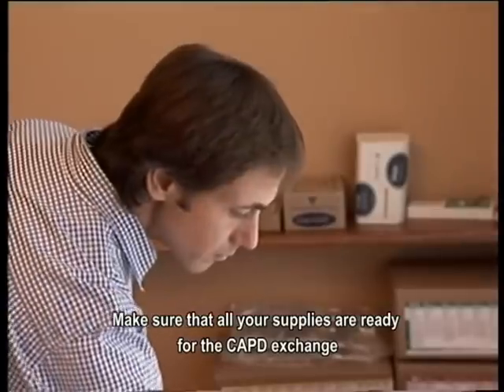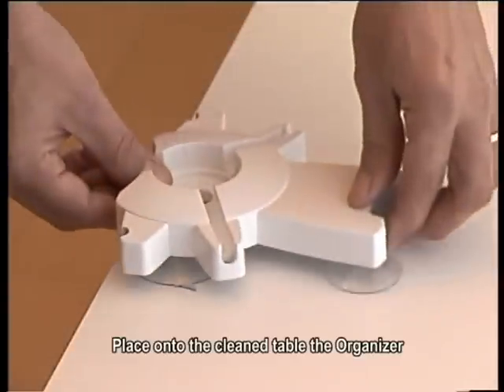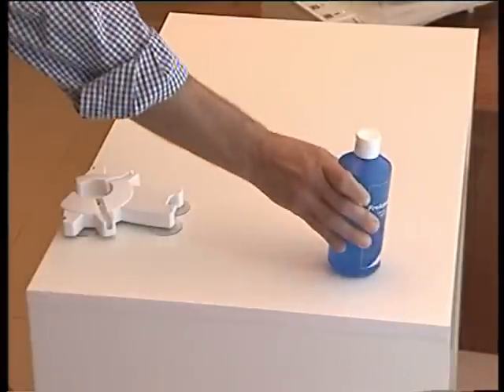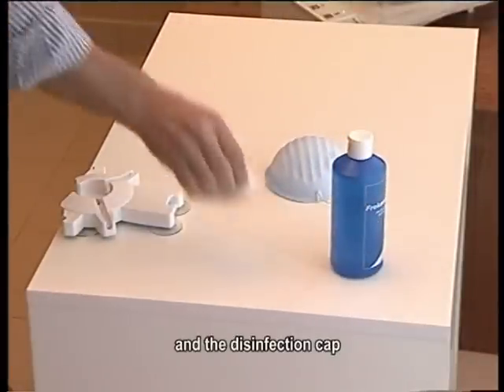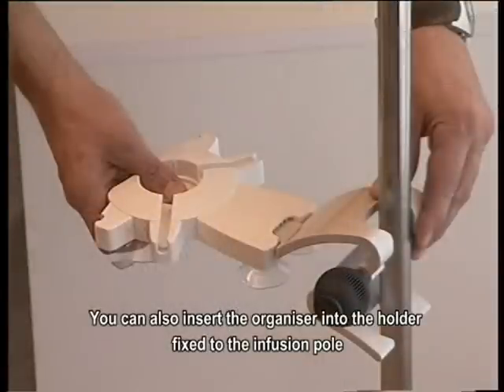Make sure that all your supplies are ready for the CAPD exchange. Place onto the clean table the organizer, the Frecasept, the mask if required by your PD center, and the disinfection cap. You can also insert the organizer into the holder fixed to the infusion pole.